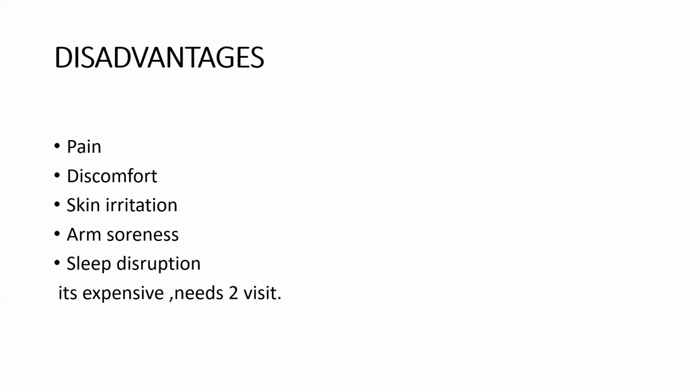All right, so just respond to the initial one I said. Thank you. Okay, Chief, I heard the dippers and non-dippers, but for the PVC burden, that's the only part I heard. I didn't hear the other part of the question. For ambulatory ECG, we are assessing PVC burden. The other burdens I didn't hear. Yeah, PVC and SVT burden. Okay, SVT.